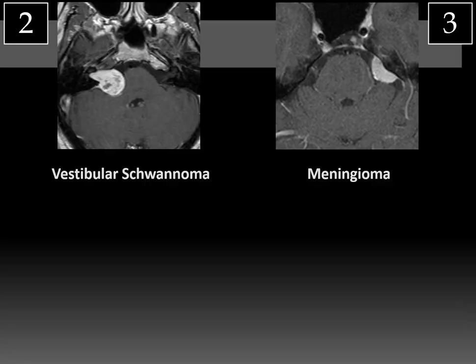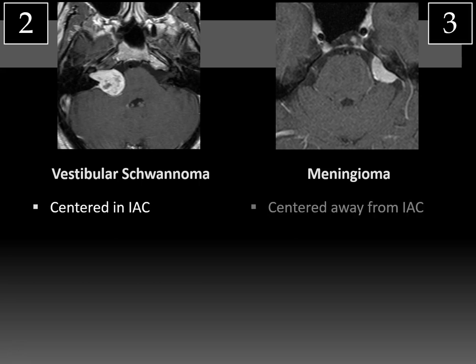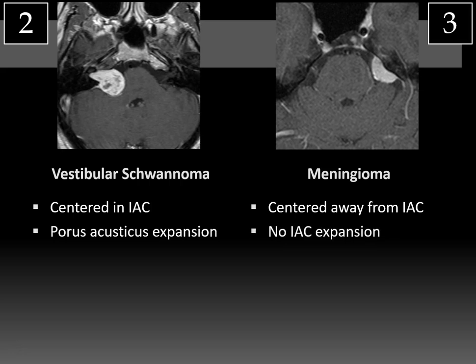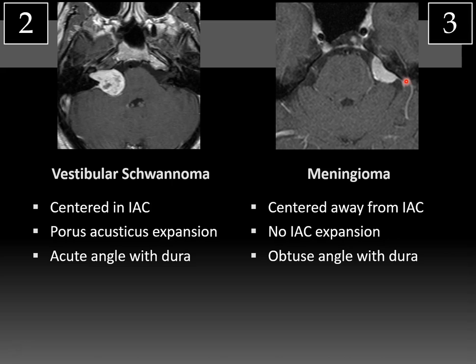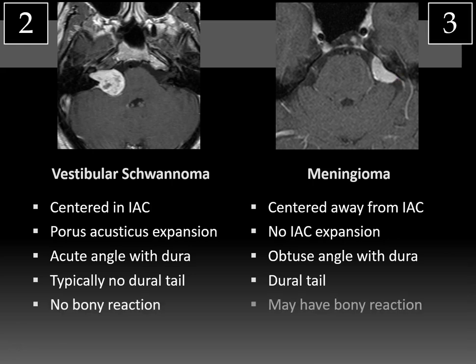Cases 2 and 3 — the vestibular schwannoma and the meningioma at the CP angle. Schwannomas tend to be centered in the IAC, whereas meningiomas are centered away from it. Schwannomas expand the porous acousticus — the medial aspect of the internal auditory canal — whereas meningiomas, even if they extend into the IAC, will not typically expand it. Schwannomas form an acute angle with the dura overlying the petrous temporal bone; meningiomas form a more obtuse angle. Schwannomas typically lack a dural tail, while meningiomas more commonly have dural tail enhancement. Schwannomas have no bony reaction; meningiomas may show hyperostosis or erosion.